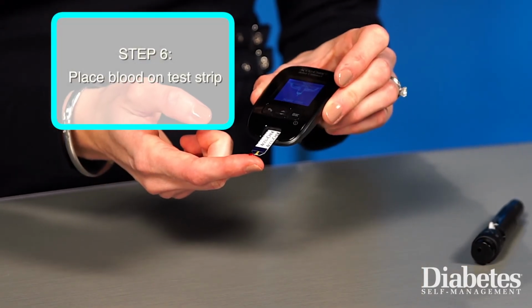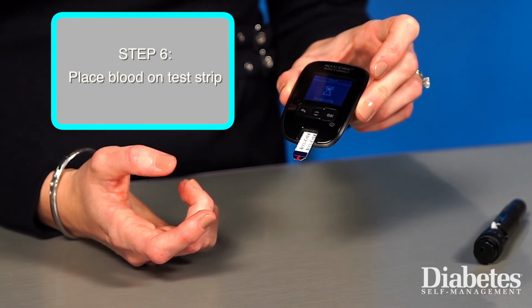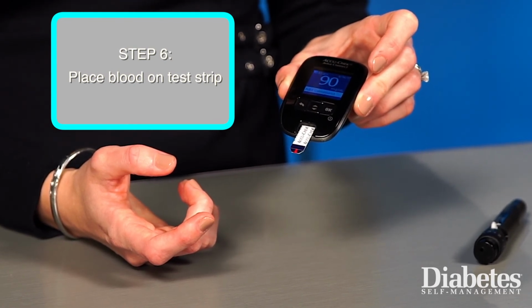Place the drop of blood on the test strip. Often you just need a small sample of blood. It should take only a few seconds to see your blood glucose result.